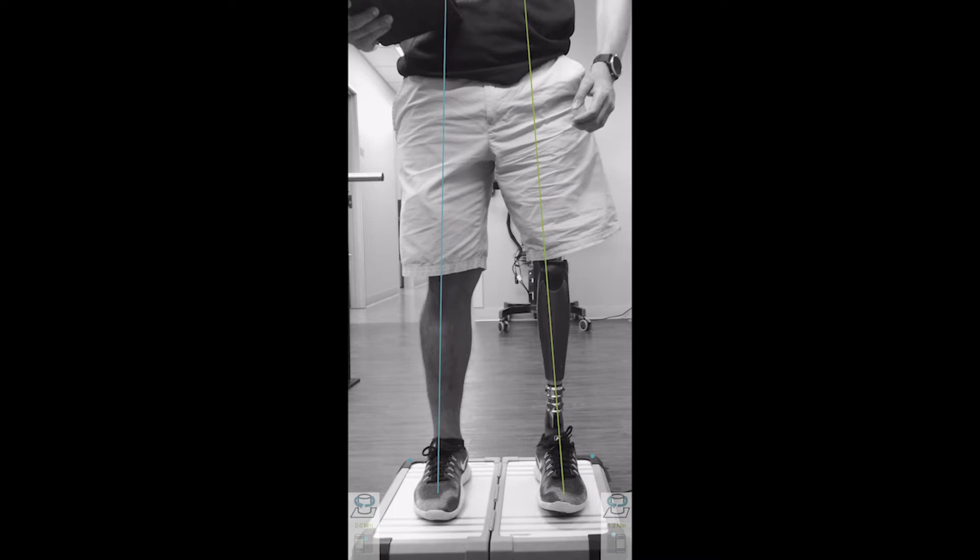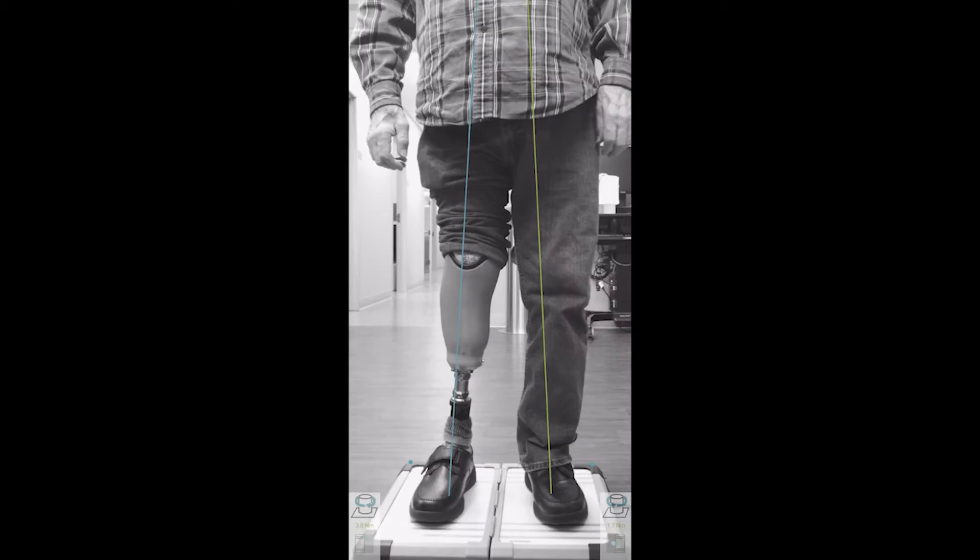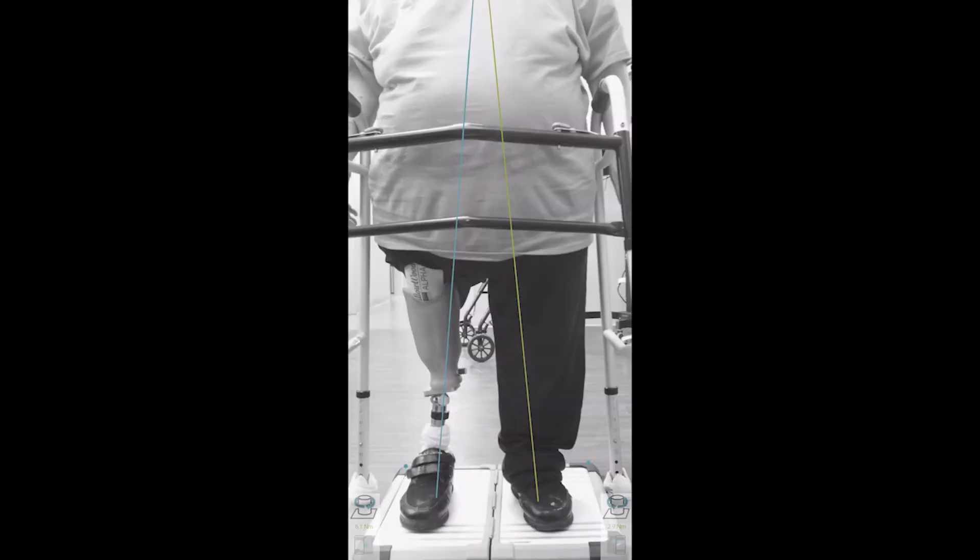Now let us look at examples of images that indicate an adjustment is necessary. In this patient's image, you will notice that the prosthetic line originates from the medial or inside portion of the prosthetic foot and then continues to run through the knee appropriately. This image suggests that the outside or lateral portion of the foot needs to be brought down so the foot is flat on the floor and evenly loaded. If left uncorrected, the patient will likely feel as though the prosthesis falls outward or away from them as they are walking, which could hinder their confidence and ultimately their level of function. In a similar image of another patient, the line does not begin in the middle of the foot and does not continue through the middle of the knee. This indicates we need to make an adjustment not only to the foot so it is flat on the floor, but also where the foot attaches to the patient's socket to bring it further out from underneath them.